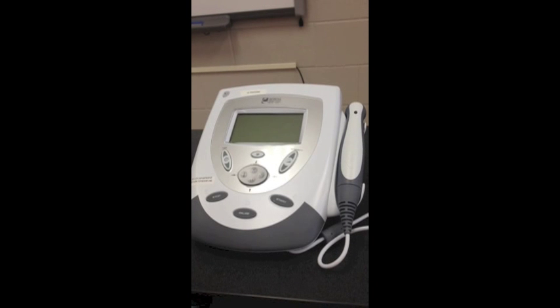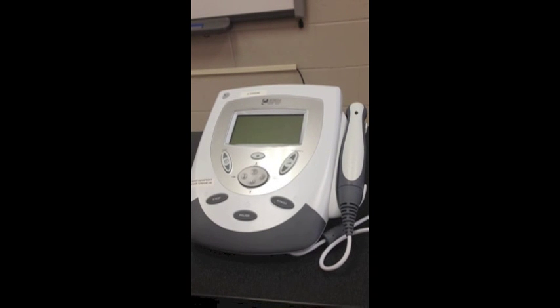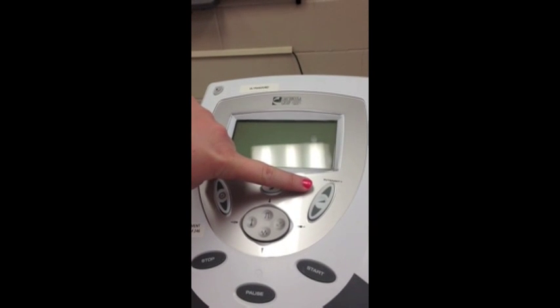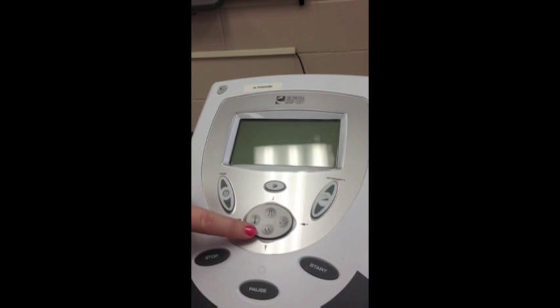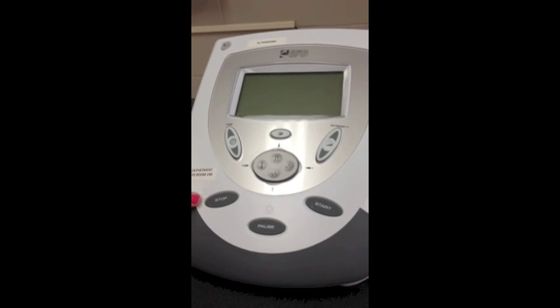We will be discussing non-thermal ultrasound use. Description. These are the buttons essential for non-thermal ultrasound use: power button, time, intensity, duty cycle, frequency, and the start, pause, and stop buttons.